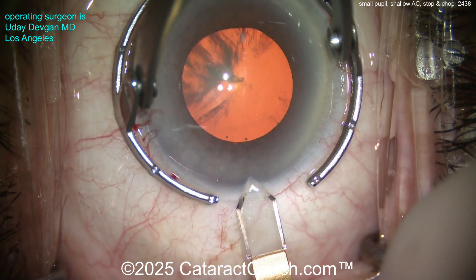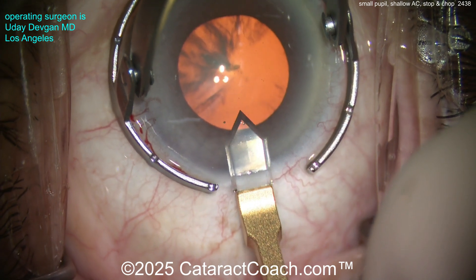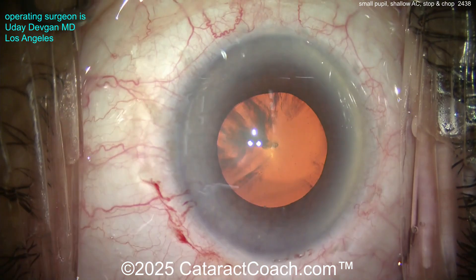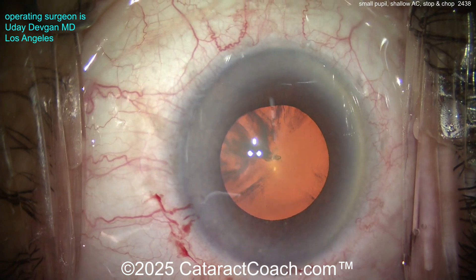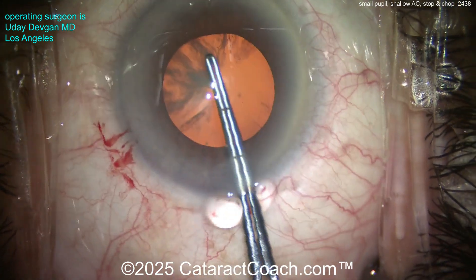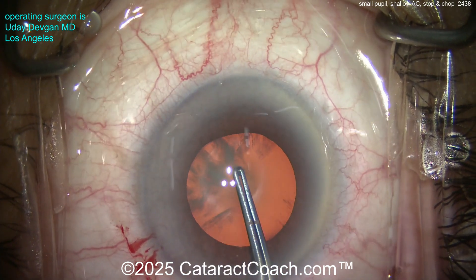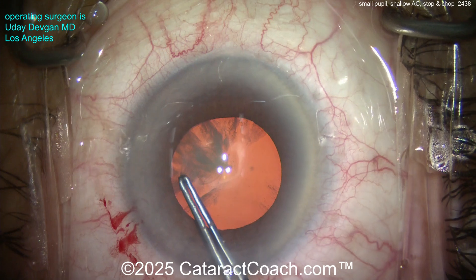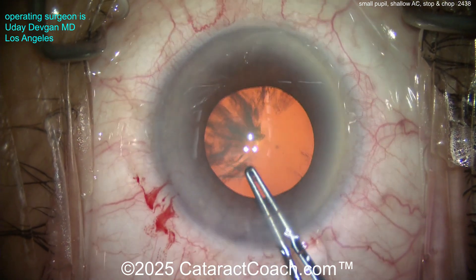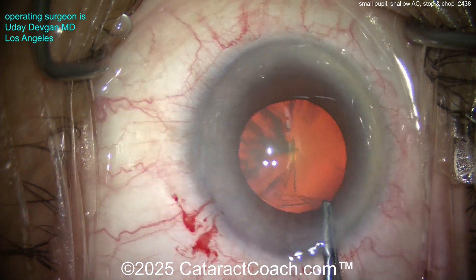This is enough for now. Here's the catch: the patient is a family member of an ophthalmologist — a good one who has sent me a ton of patients. The patient's other eye had a lot of problems: initial surgery elsewhere with complications, a vitrectomy, a corneal transplant, another DMEK — and the other eye is basically at about 20/200 vision. This patient has been very nervous about having this eye done, so obviously the pressure is on.